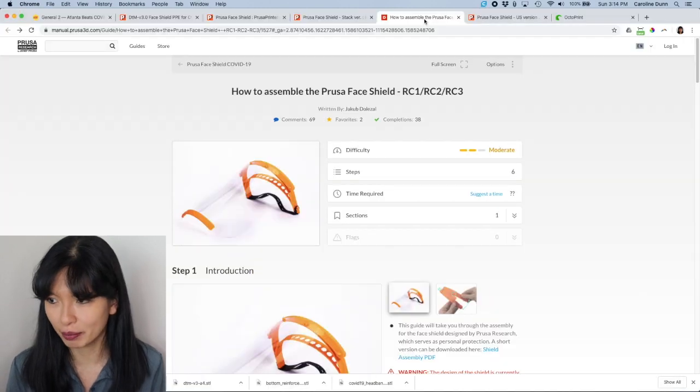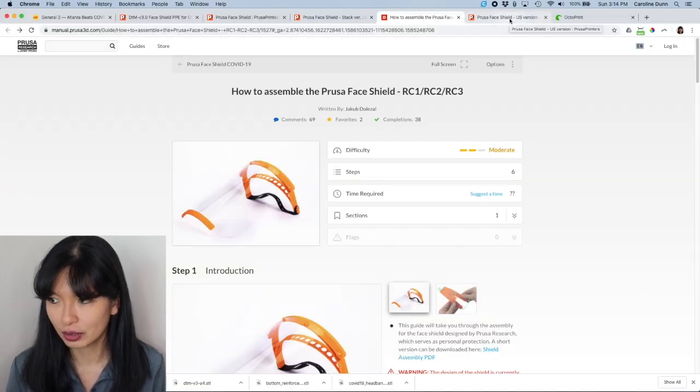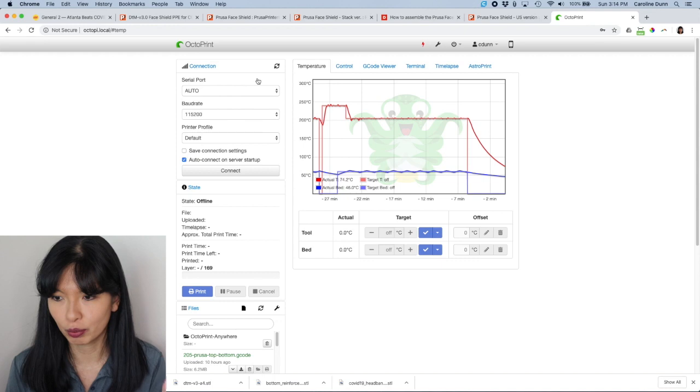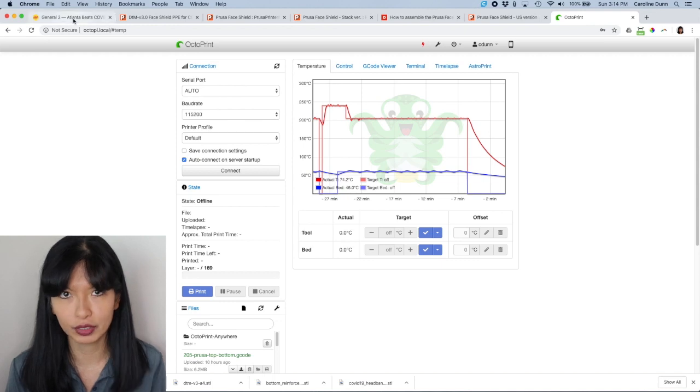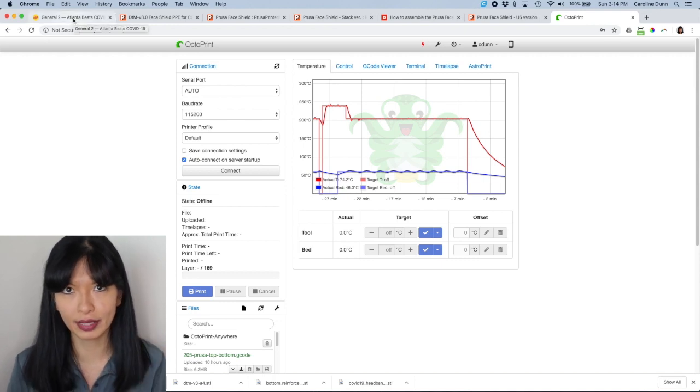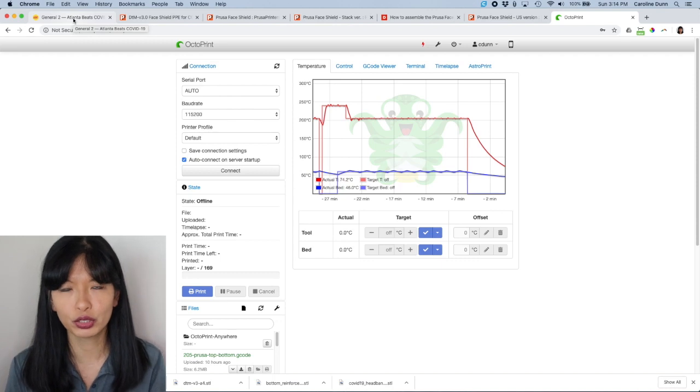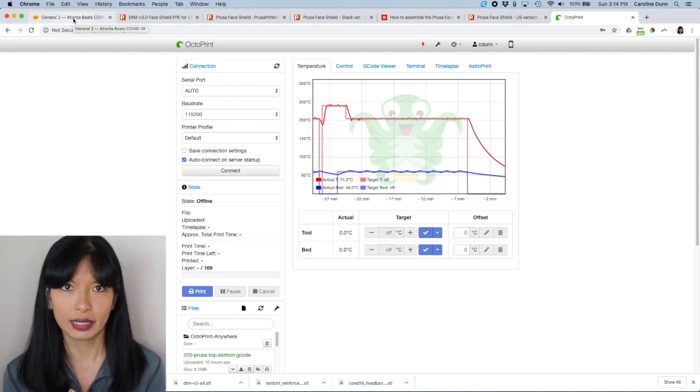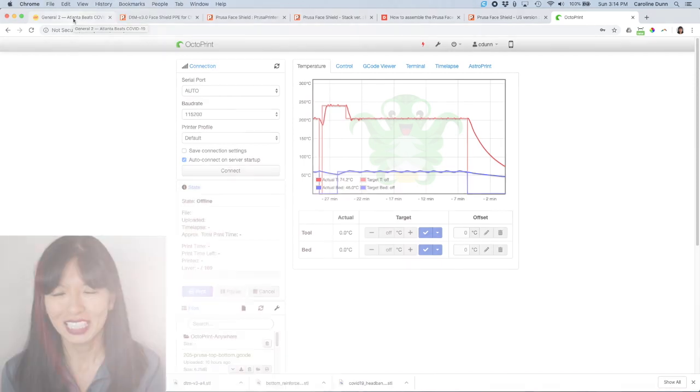Yeah, they do have how to assemble the face shield. And then, of course, Octoprint, hopefully you have to set that up. If not, then you'll have to save this to your micro SD card and then put it in your printer if you have an Anet A like I do.